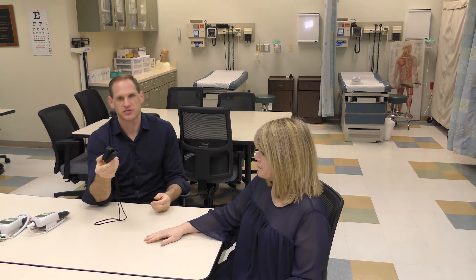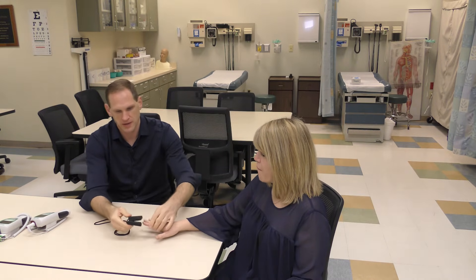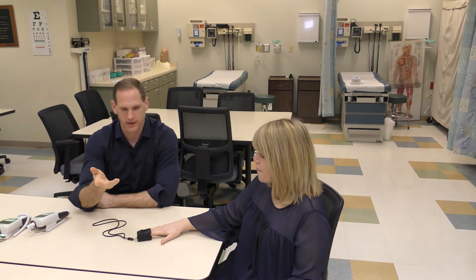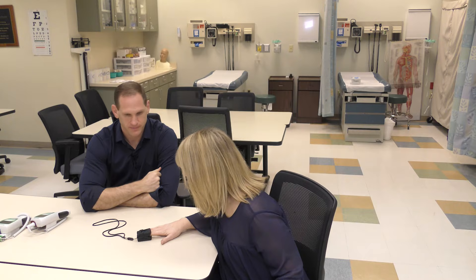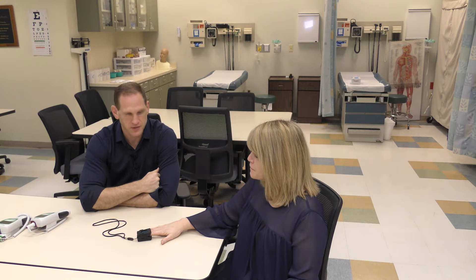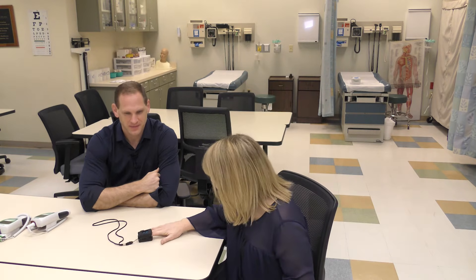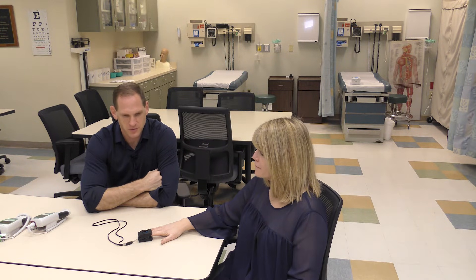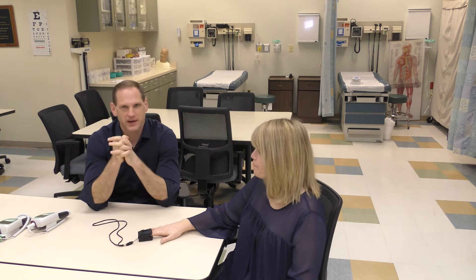Pulse ox devices come in small portable versions and also very large ones. You turn it on, place it on the patient's fingernail, wait for it to beep, and it will tell you their SpO2 and their heart rate. At the moment it's reading a heart rate of 48 and an SpO2 of 91 — though the heart rate is now coming up to 61 and the SpO2 is still 90, probably because it's cold in here, which is causing vasoconstriction of her finger and impairing the reading.